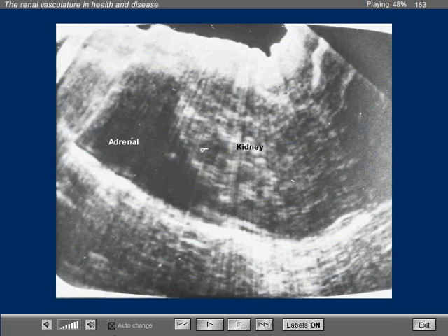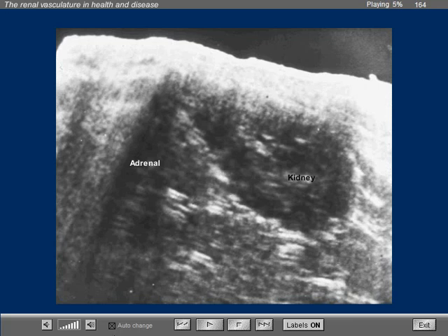Echographic examination of the left kidney revealed echogenic areas scattered through the kidney, which appeared enlarged, and also echoes coming from an enlarged left adrenal gland. Repeat echographic examination revealed the resolution of the adrenal hemorrhage and also a return to an almost normal size and echogenicity of the left kidney. This baby had an episode of left renal vein thrombosis, which was a reversible situation.